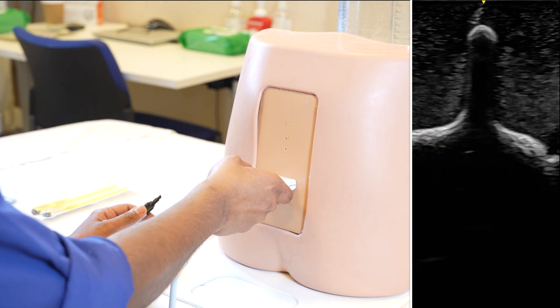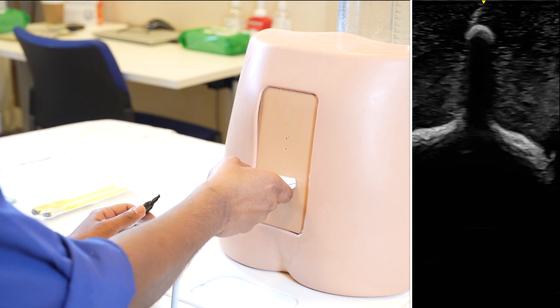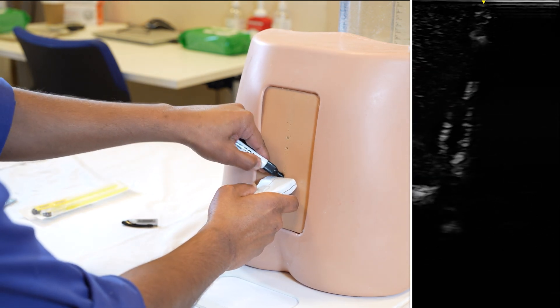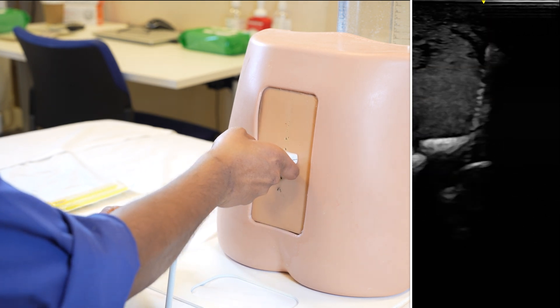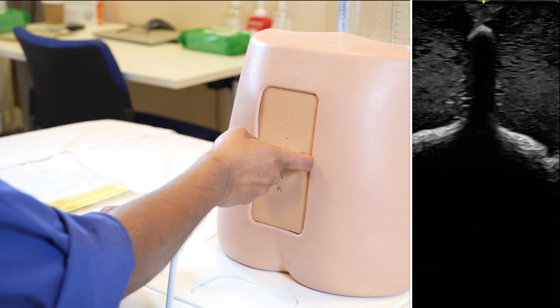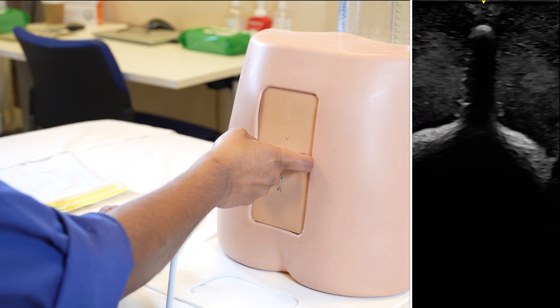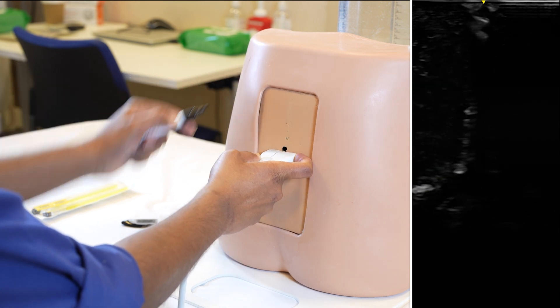Once I get a crisp picture of a hyperechoic hump with an acoustic black shadow behind it, and it's in the midline, I know this is my L5 spinous process and I mark that with a marker. Then I gradually go up to get the next crisp hyperechoic hump with the black acoustic shadow behind it. Once I get it in the midline and I'm confident that it's in the midline, I mark that — that is my spinous process for L4.